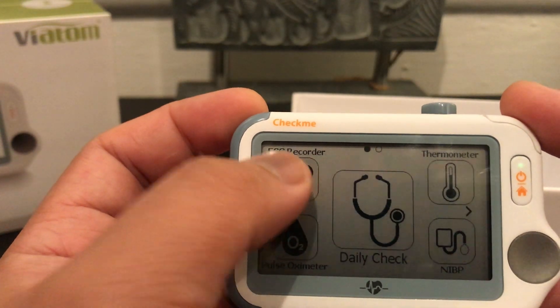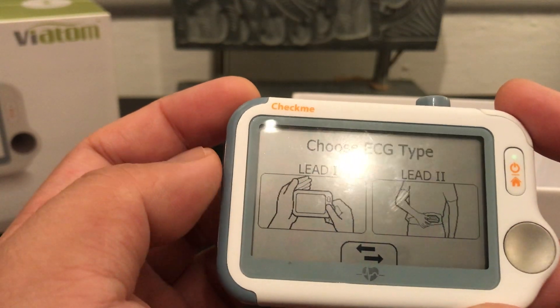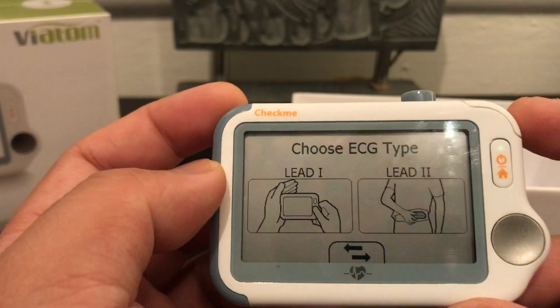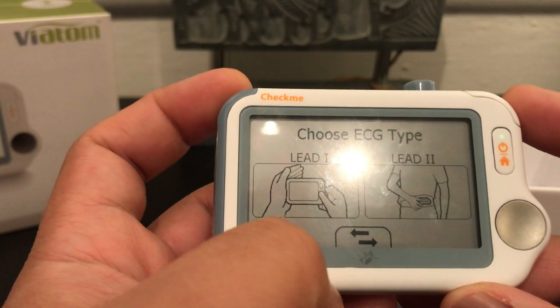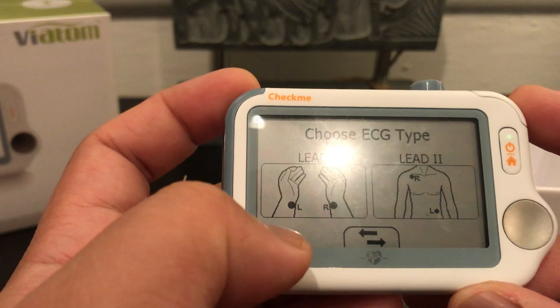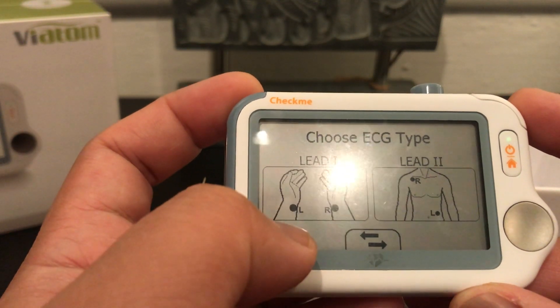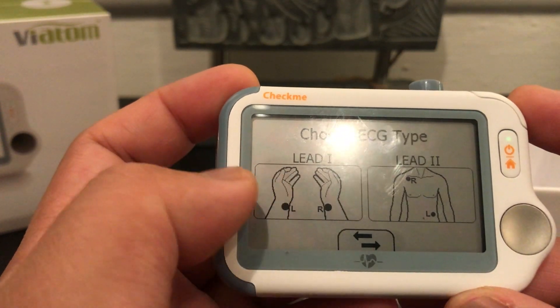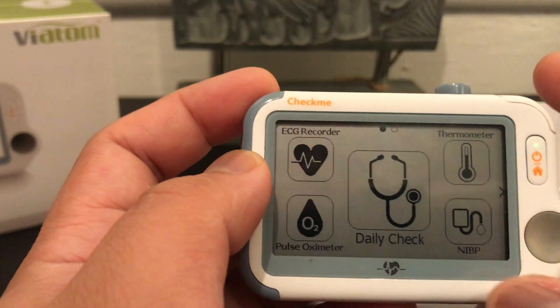Let's first use the device to check our EKG. Hit this icon and it's going to ask you whether you want lead one or lead two. Lead one is using your hands, lead two is putting the device on your belly. Going to the next page, lead one again is using the external cables for your hands or for your upper chest and lower abdomen.